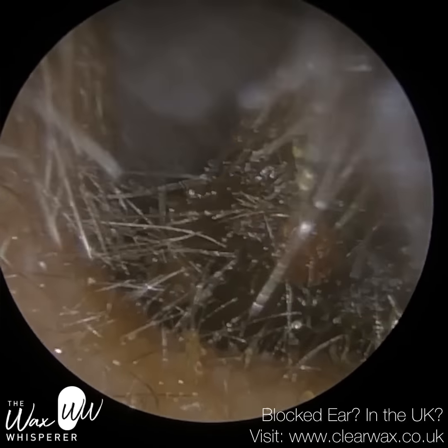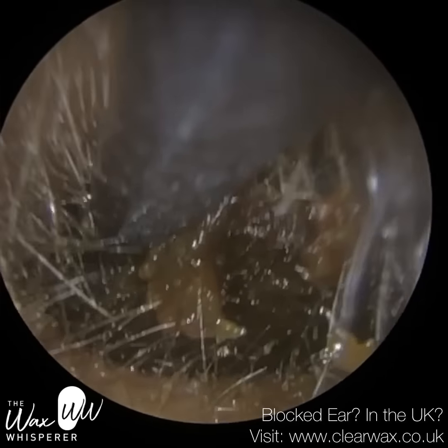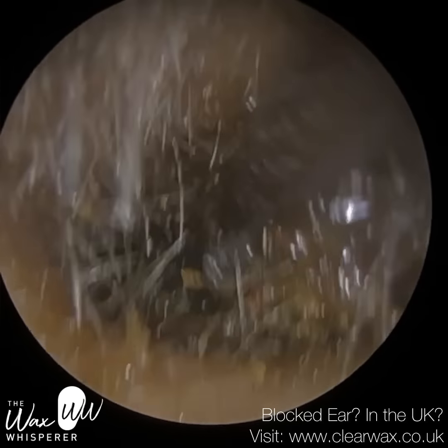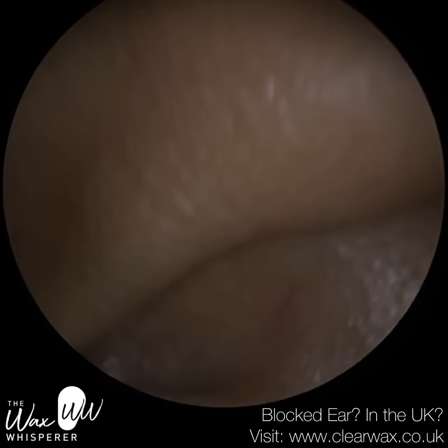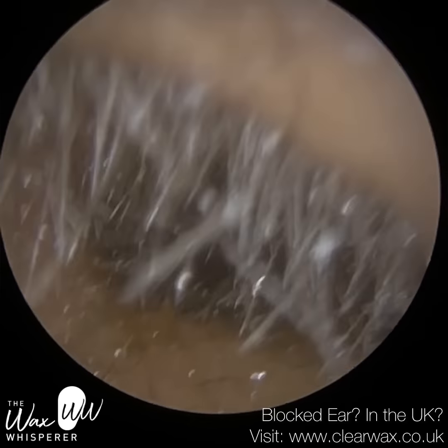If we start trimming these hairs, some of them will fly into the ear. You can put some cotton wool in there, but this patient already has wax so you could potentially further impact it. In addition, some of these hairs will go into the environment, and being a clinical space we don't really want that.